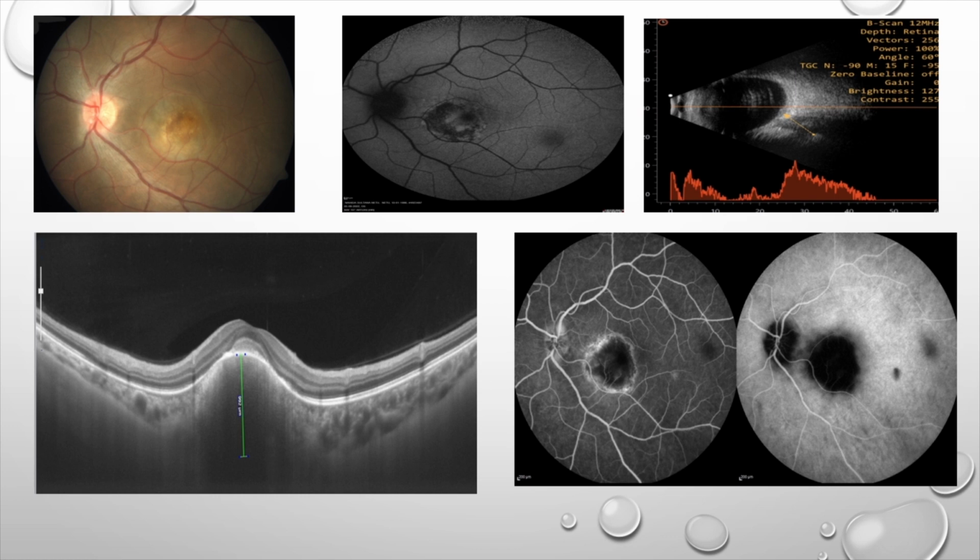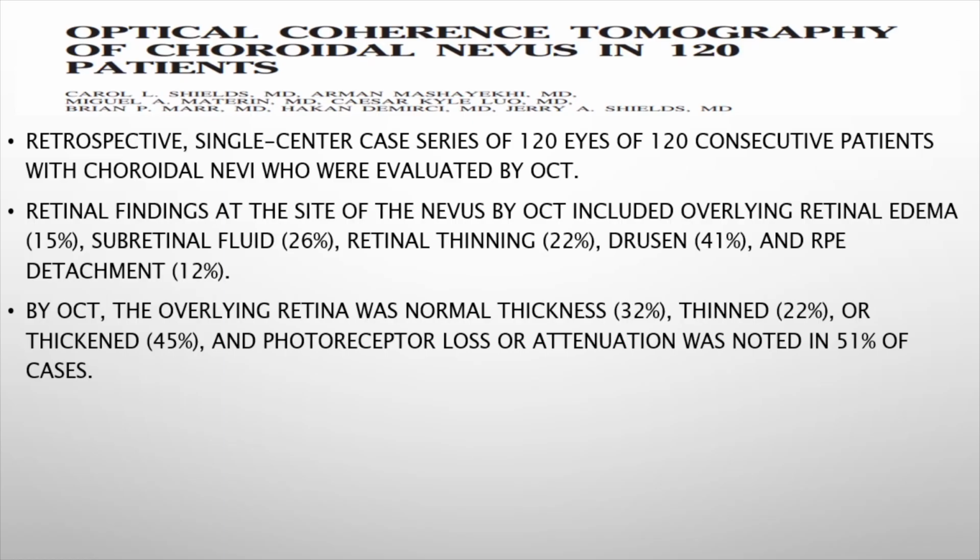So that is what it's not going to be a one-time event. When you see a patient, you're going to monitor the patient serially. And when you see that there is an increase, the question of observation versus treatment arises. So this was a study done by Shields et al.